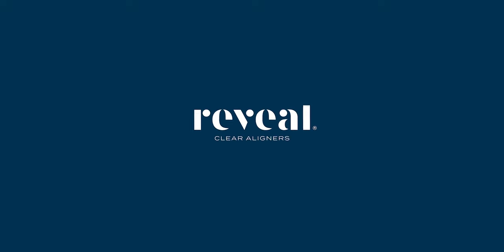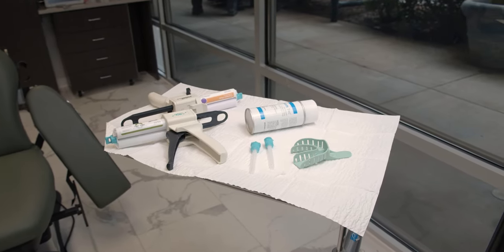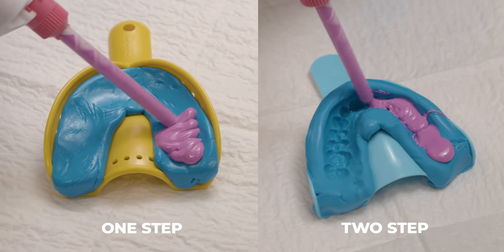Hi, today I'll be showing you the approved methods and techniques for taking impressions for Henry Schein Orthodontics aligners. There are two techniques that you can use when taking impressions: the one-step or the two-step technique.